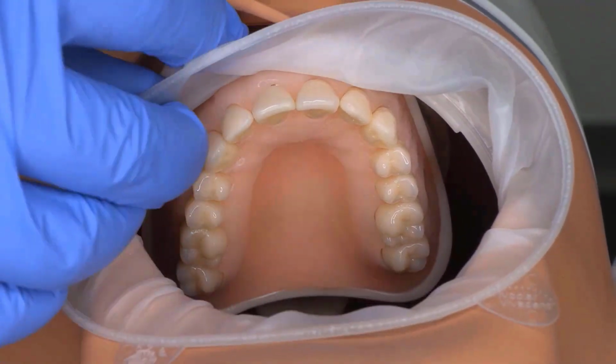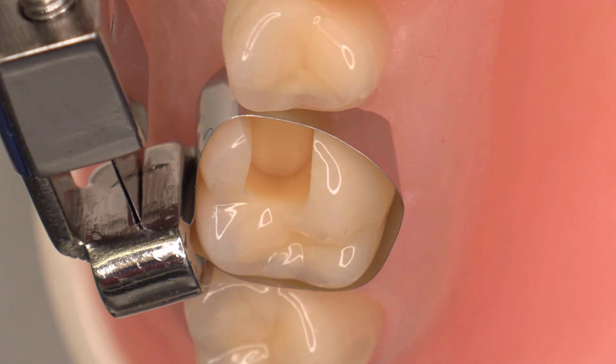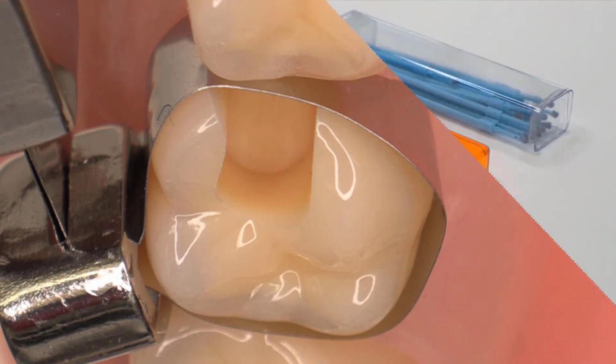The use of buccal pad, cotton rolls and a saliva ejector is recommended to reduce the saliva contamination. The cavity preparation design is defect orientated, therefore no undercuts, grooves or further healthy tooth tissue removal is necessary. All sharp edges and angles should be rounded off. Since the cavity preparation design is defect orientated with no macro retentive design, an adhesive primer is necessary for the micro retention of the restoration.